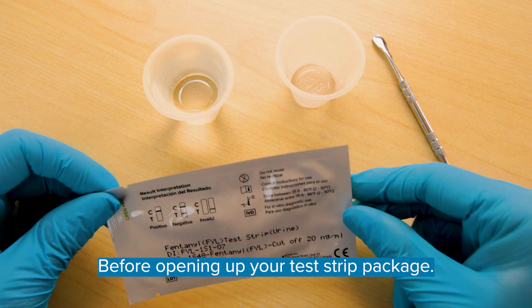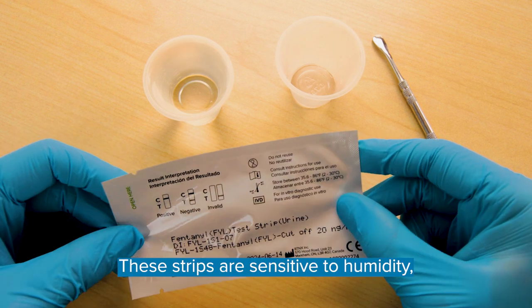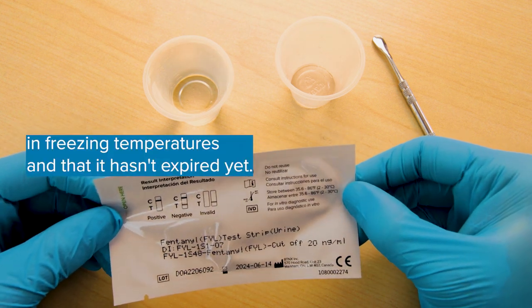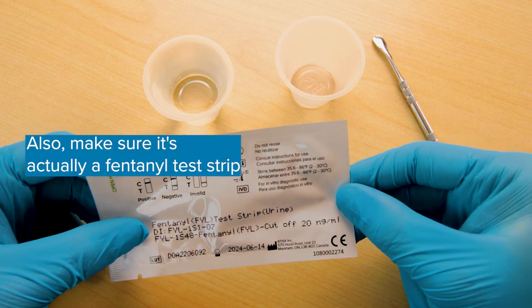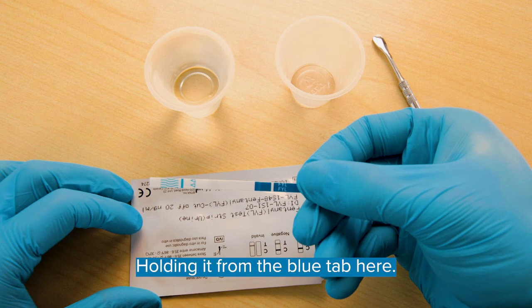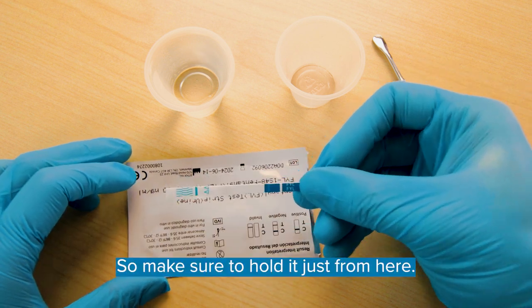Before opening up your test strip package, inspect for any visible defects — any rips, tears, or punctures anywhere on the package. These strips are sensitive to humidity, so we want to use them right after they've been opened. Make sure it hasn't been stored in freezing temperatures and that it hasn't expired yet. Also make sure it's actually a fentanyl test strip, as there are different kinds. Open up your test strip, holding it from the blue tab here, and check to make sure it says fentanyl on it. Holding it from anywhere else can invalidate the test, so make sure to hold it just from here.